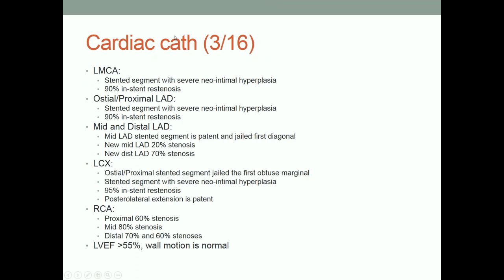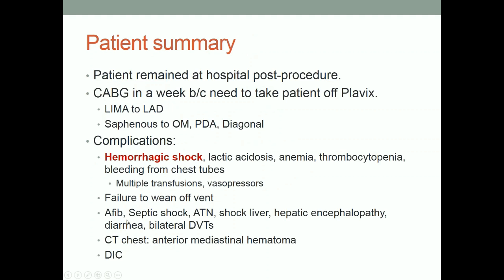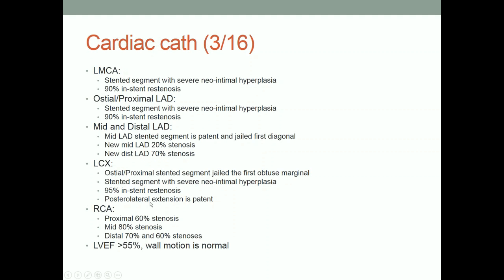So in conclusion, this gentleman had a stented segment of the main left with, after bare angioplasty on some of it and the stent extending into it from the LAD, now a big problem in the main left that we didn't have before. Now we got some ostial LAD problem, and all this stuff scattered around, which was scattered around before. And we got the first good look at the right that has an 80% lesion. So obviously this guy's going to have surgery. And he's stable, but he has a lot of problems.